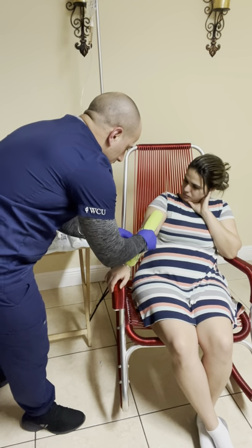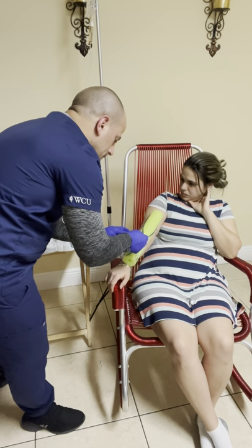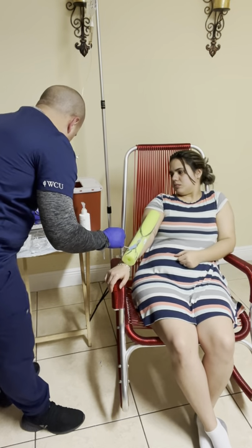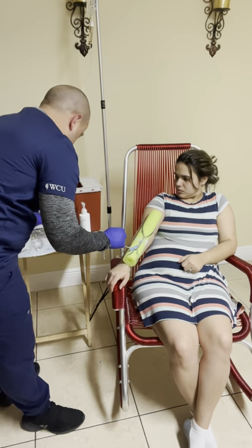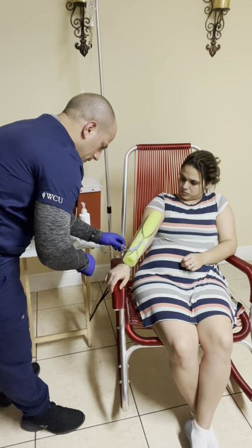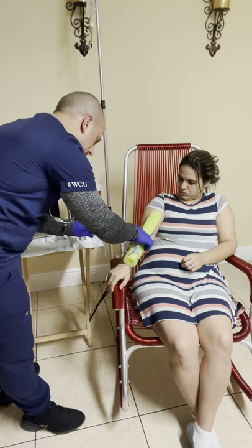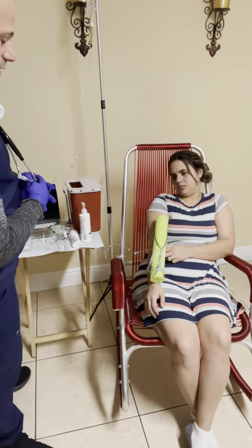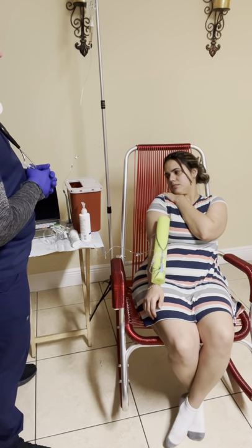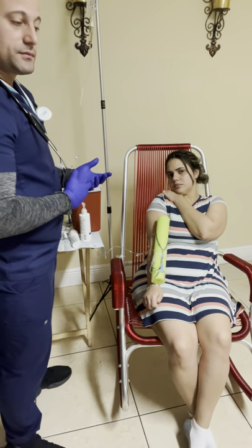Now I'm going to clean the port and place the IV bag. Before placing the IV line in the extension of the patient, I have to set up the infusion pump, okay?